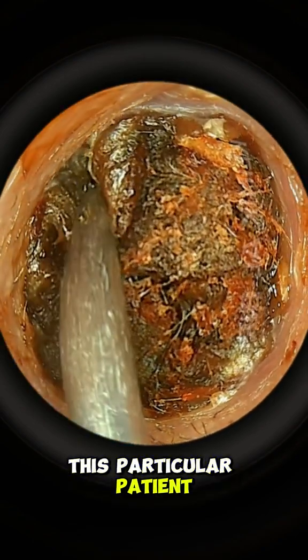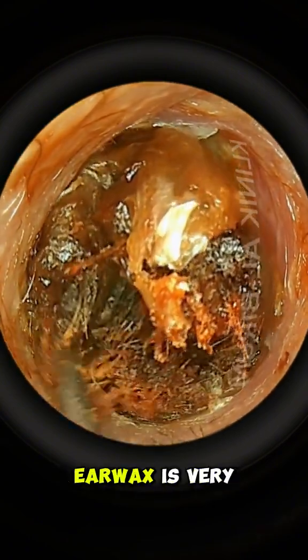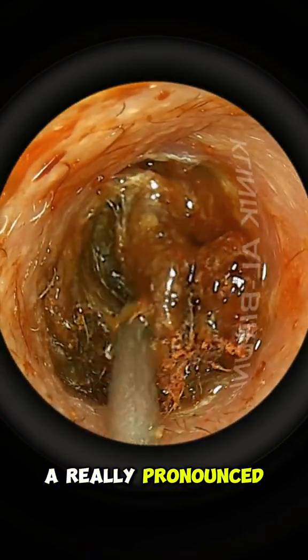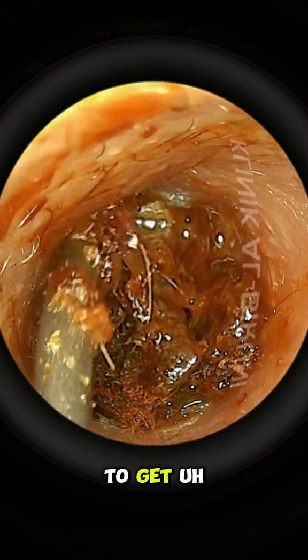Now, this particular patient tends to suffer with a much softer, stickier type of earwax. It's very deep in the canal, so we're heading down to that osseous portion. And what we've also got is a really pronounced first bend in here. So you can see we're struggling to get around that corner.